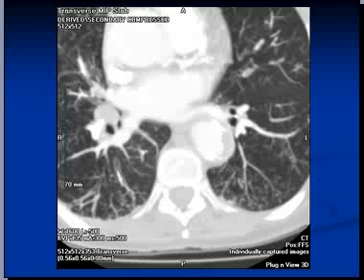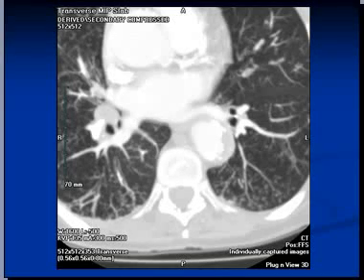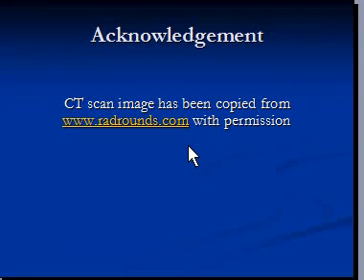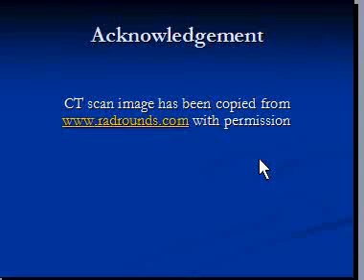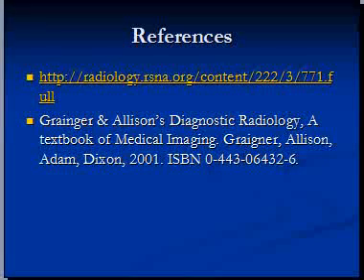In short, many infective processes, certain cancers, and even inhalation of certain chemicals can cause this pattern. Under the microscope, these prove to be inflammation with caseous matter in bronchial cells and alveolar ducts. The CT scan image has been copied from www.radrounds.com with permission, and these are the references. Thank you very much.